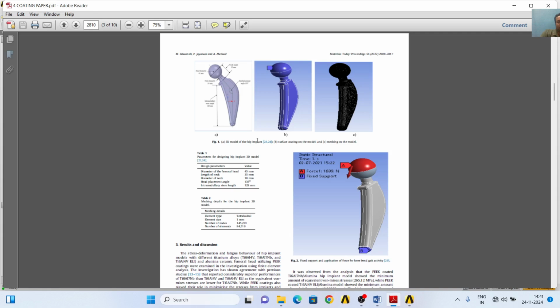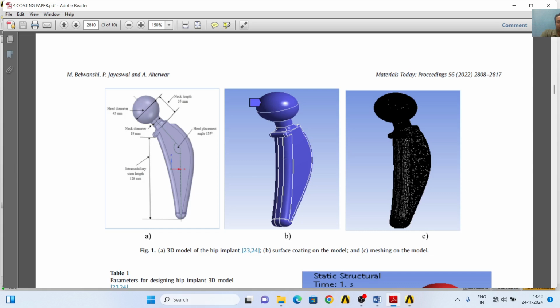In this video I am going to show you how to investigate the fatigue behavior of a hip implant geometry. As you know, this is a hip implant geometry in which this lower part is called the stem and this upper part is called the head, and we will apply two materials. We will use titanium 6Al4V for the stem and alumina for the head, then apply some appropriate forces and calculate the fatigue behavior. In fatigue behavior we will calculate the estimated life for the particular forces, and the forces at which this implant geometry will fail. So for better understanding, please watch till the end, and we will now start our video.